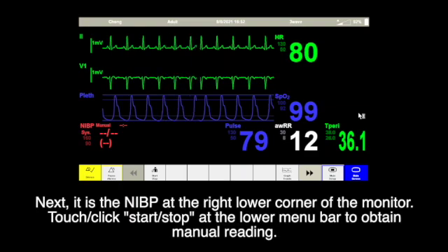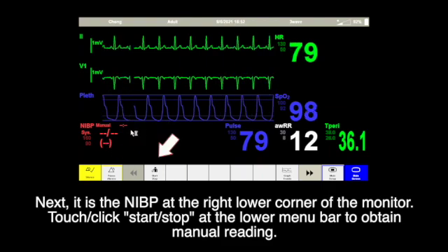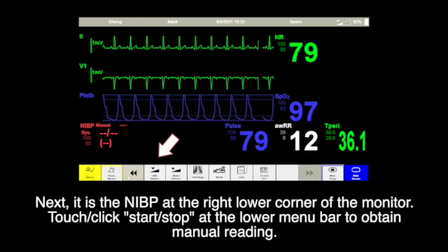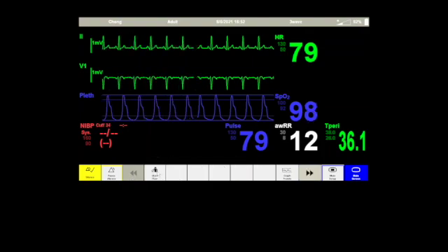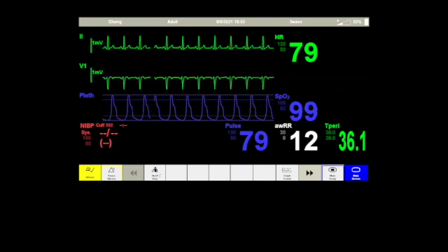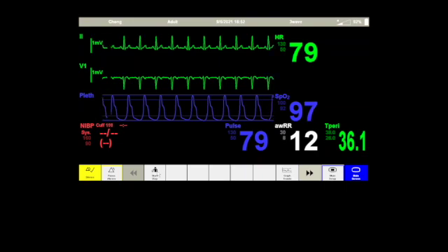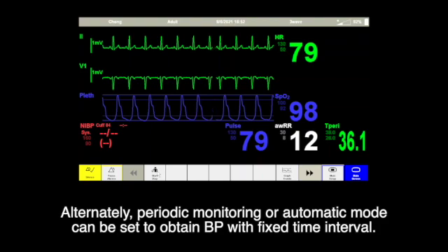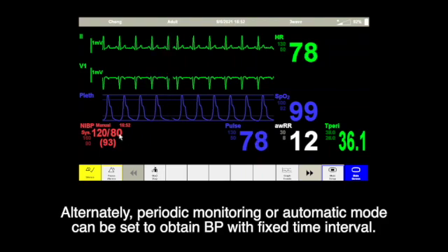Next, the non-invasive blood pressure is at the right lower corner of the monitor. Touch or click the start or stop button at the lower menu bar to obtain a manual blood pressure reading. Alternatively, periodic blood pressure monitoring or automated mode can be set to obtain blood pressure with a fixed time interval.